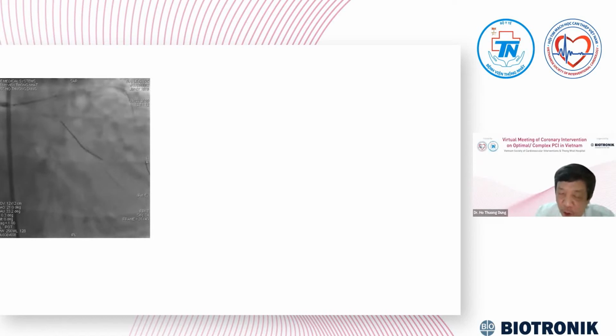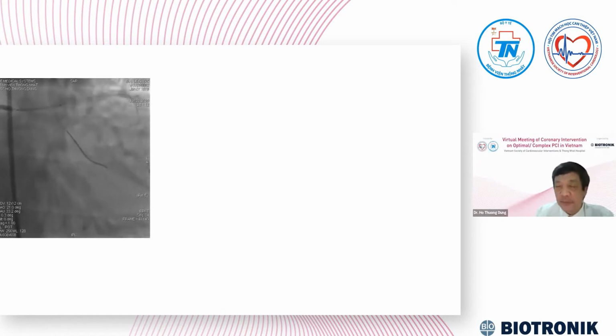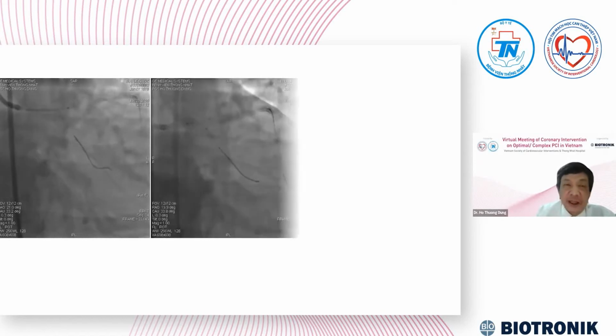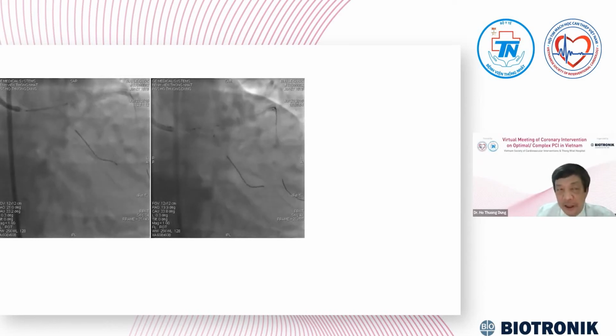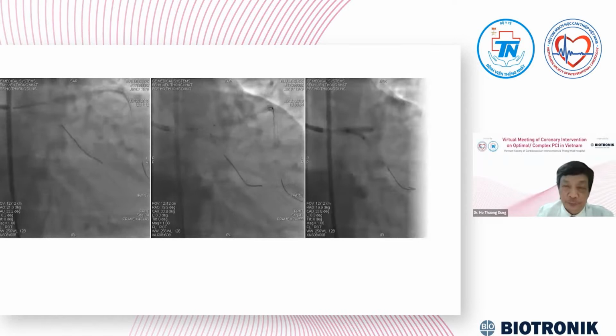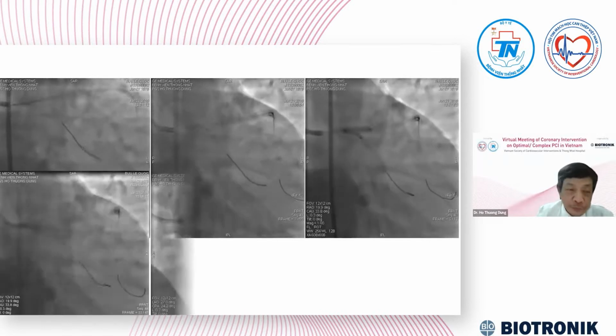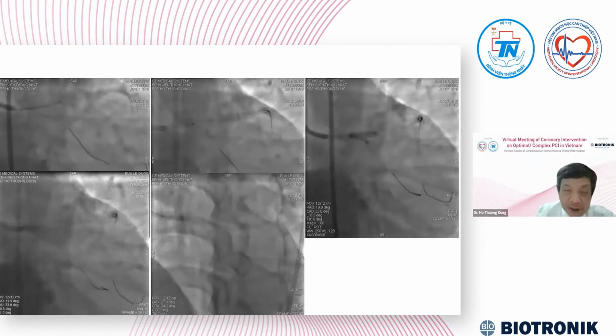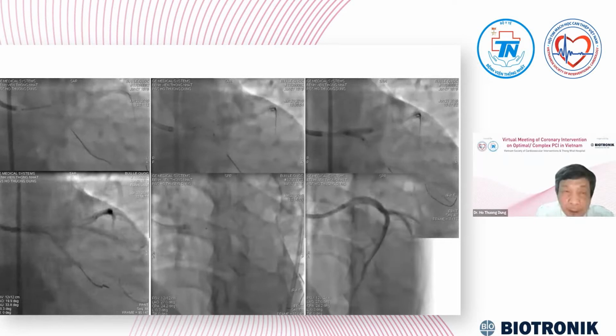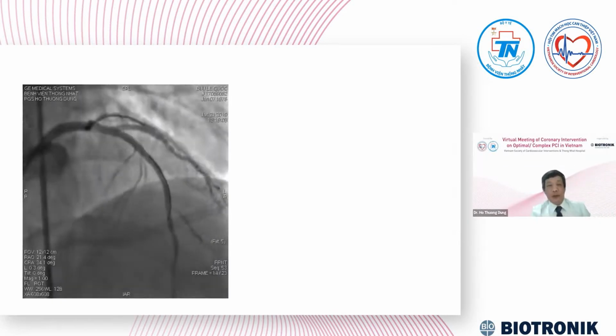We used a small stent, 2.25 millimeter, to keep the ostium of the circumflex, and a stent from the left main to the proximal LAD, 3.0. And we did the final kissing balloon. And I think the final result looks okay.